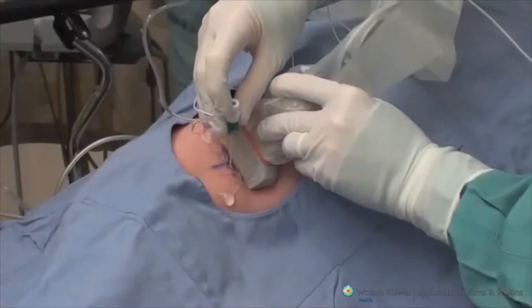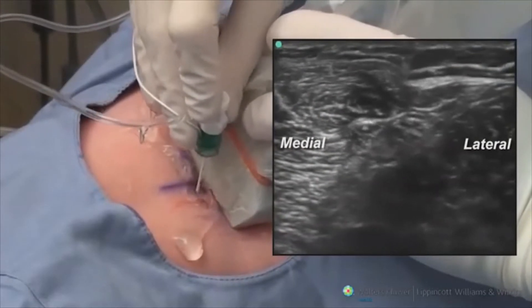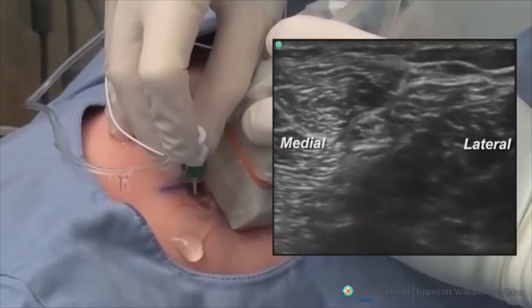A 5 cm 18 gauge needle is attached to the nerve stimulator and inserted out of plane to the probe. The needle is then advanced slowly through the lateral part of the biceps femoris muscle until it is seen to pass between the peroneal and tibial nerves.